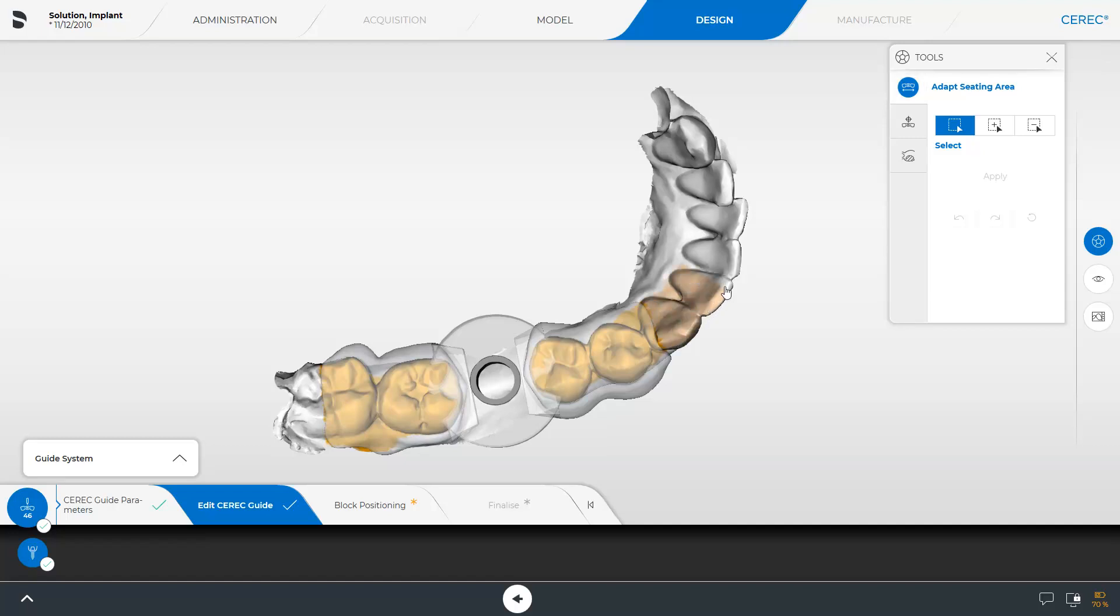Starting at the surgical guide, we mark the area to be lengthened by holding the left mouse button down or via the touch function. By tapping Apply, the surgical guide is extended.